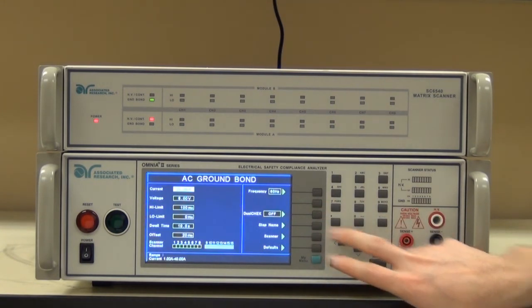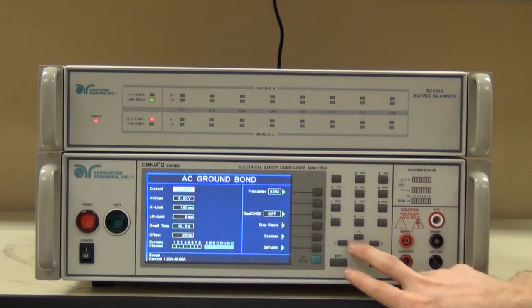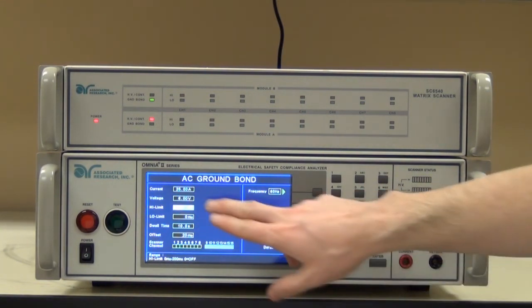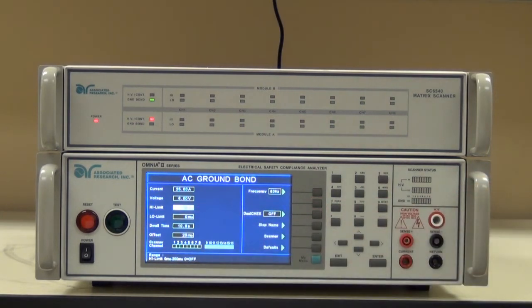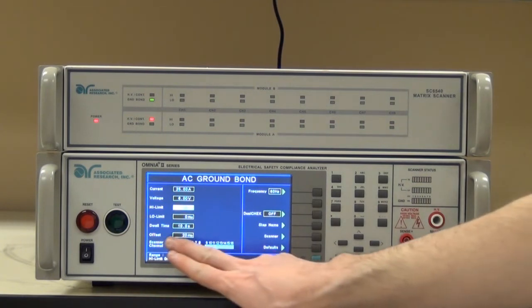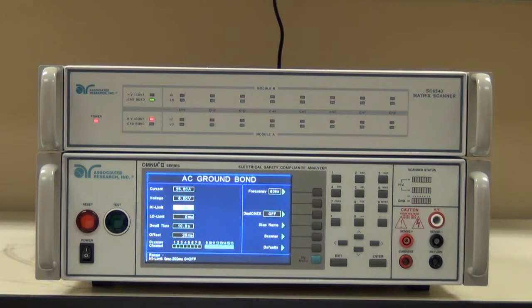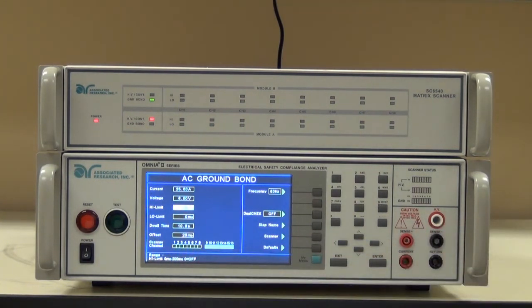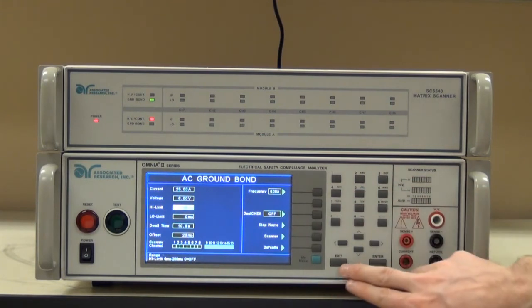Per the medical device standard, it's a 25 amp test. The voltage drop shall not be greater than 6 volts with a high limit of 100 milliohms, no low limit, a dwell time of 10 seconds or enough time to obtain a meaningful reading. I've already offset my lead resistance at 20 milliohms. I don't need to do any multi-point tests, so I haven't set any of the scanner channels, and I am doing this test at 60 hertz.